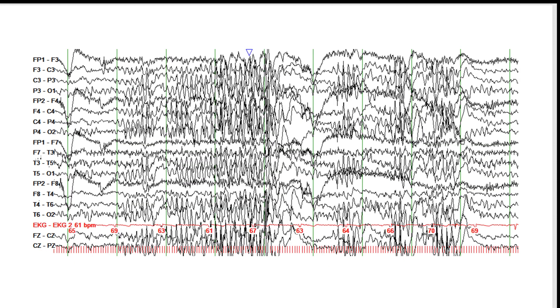This next EEG shows a photoparoxysmal response. The red lines at the bottom of the page indicate the patient is undergoing intermittent photic stimulation. Approximately 2–3% of individuals with focal onset seizures are photosensitive, approximately 15% of patients with generalized epilepsies are photosensitive, and approximately 35% of patients with juvenile myoclonic epilepsy are photosensitive — something to keep in mind when acquiring EEGs.